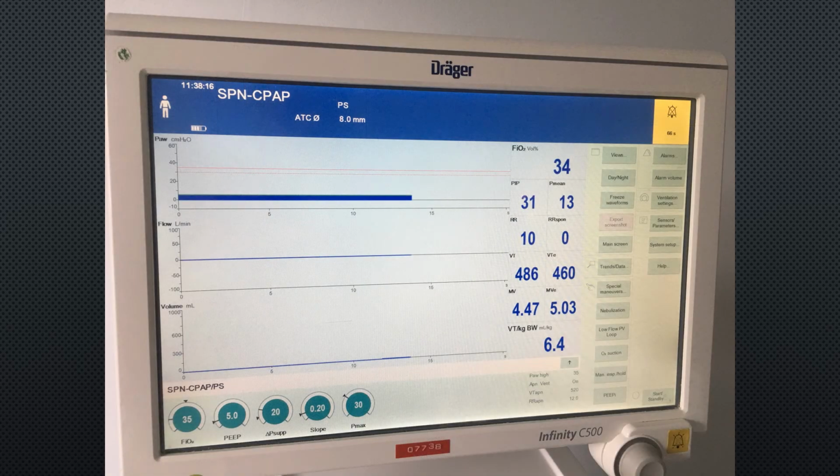There are some built-in safety features on these ventilators. For example, if the patient fails to trigger breaths in a spontaneous ventilation mode for a certain amount of time, then the ventilator will provide mandatory pressure controlled breaths. The apnea time as default is set around 15 seconds. In other words, if the patient fails to breathe for 15 seconds, the backup pressure control mode will be activated to continue with the ventilation.